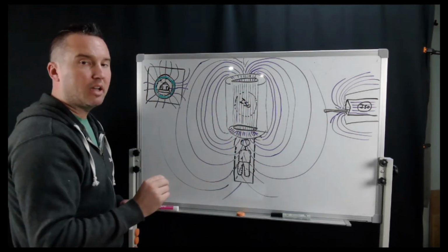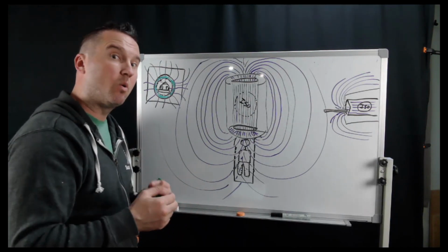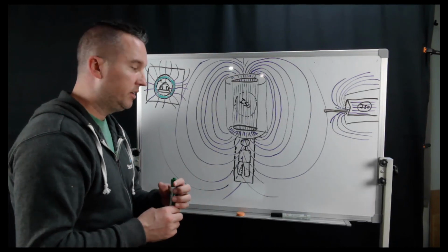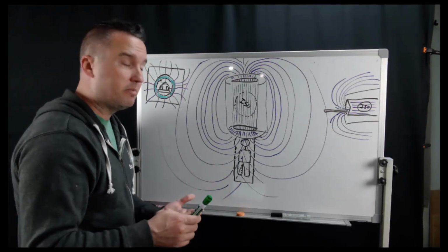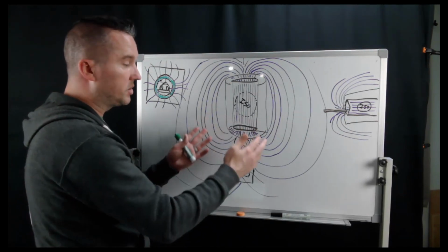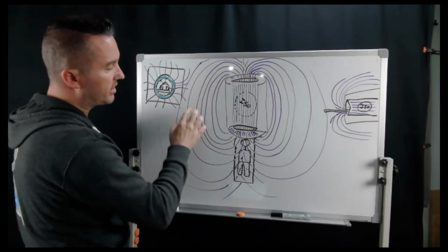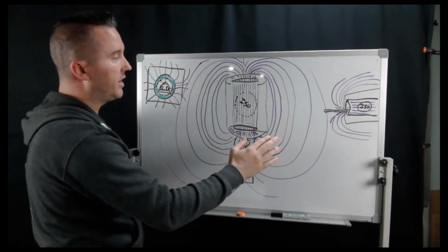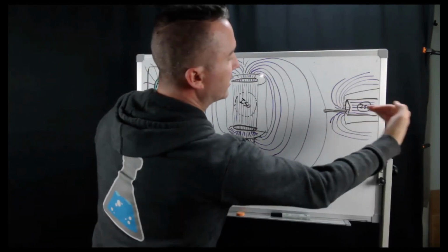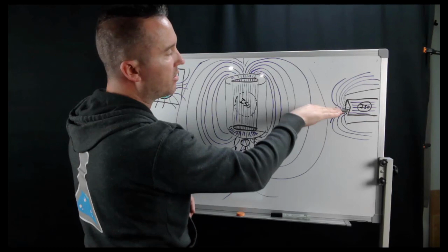of the magnet, we have two main forces that are acting on that patient or that implant or any metallic object that may find itself in the magnetic isocenter or flux line area. All of these little areas in purple are the flux lines. This way we're looking down the bore at the patient. Here we're looking sideways at the patient or at the scanner.